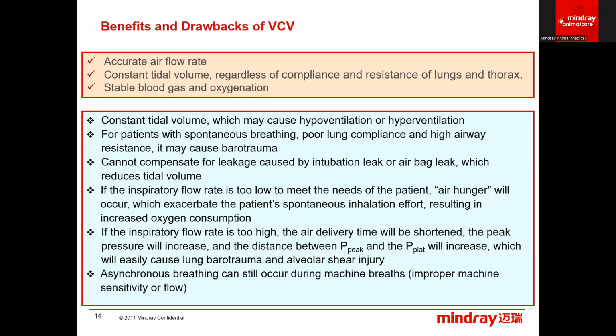Your patient might experience air hunger, which is, again, a hypoventilation type of problem, where your patient is like, I'm not getting air fast enough, I'm going to breathe around the ventilator, I'm doing additional work, I'm metabolizing faster because I'm working harder, and my oxygen consumption is increasing, and it becomes a cycle. It becomes a catch-22. Your patient is working harder to get more air, but they're having to fight the ventilator to get more air, which makes them work harder, et cetera, et cetera.